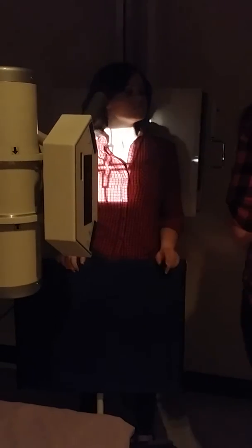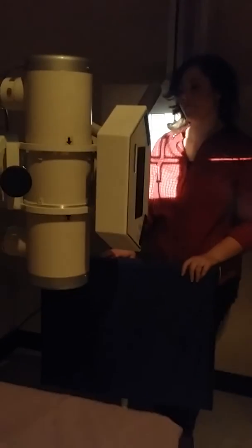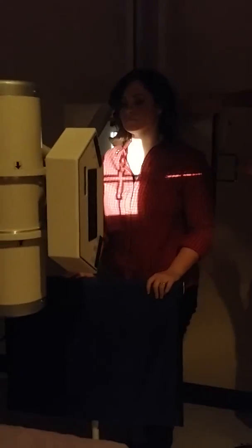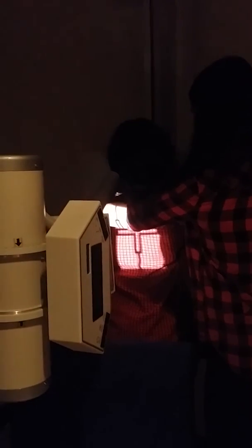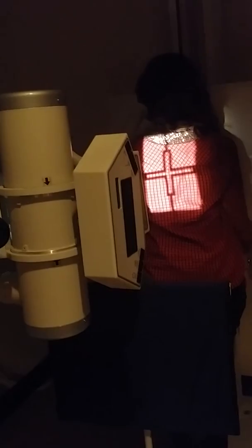For the sternum, you'll have the patient take off their bra, necklace, and everything. Then have her face the board and get as close as she can. You're going to move her into her RAO, which is 10 to 20 degrees, and you're going to enter on the elevated side.